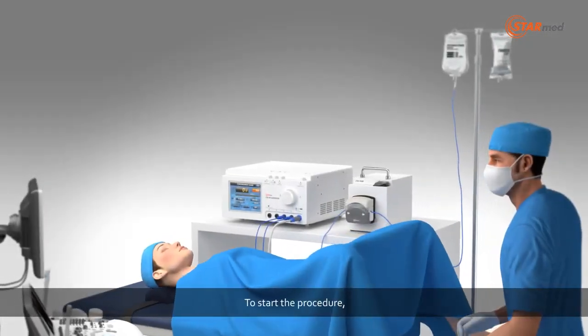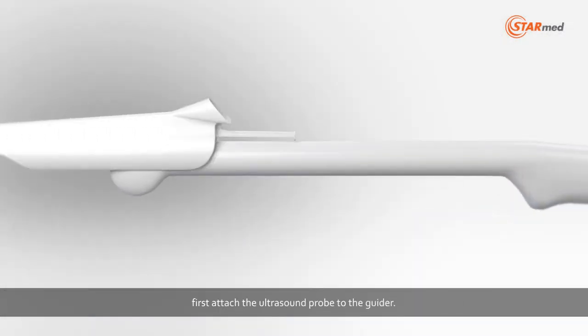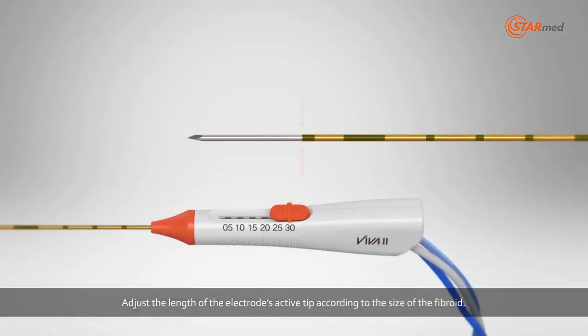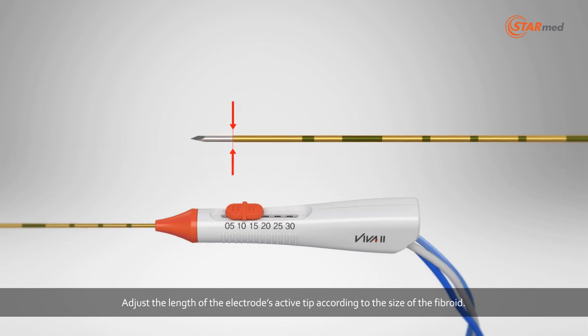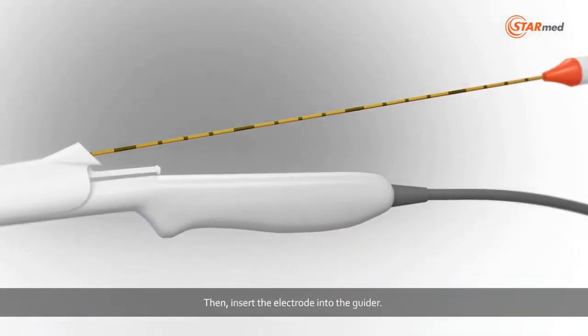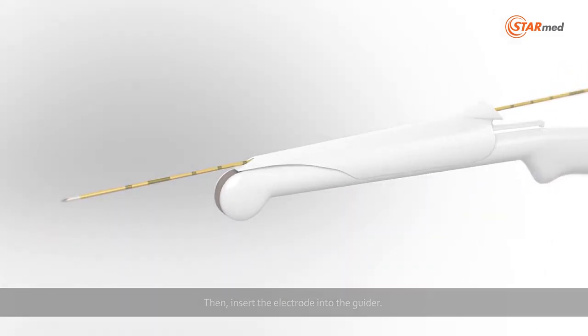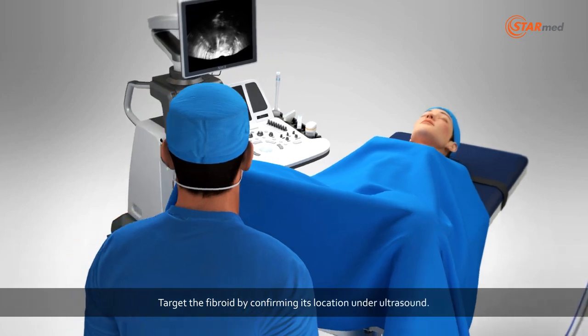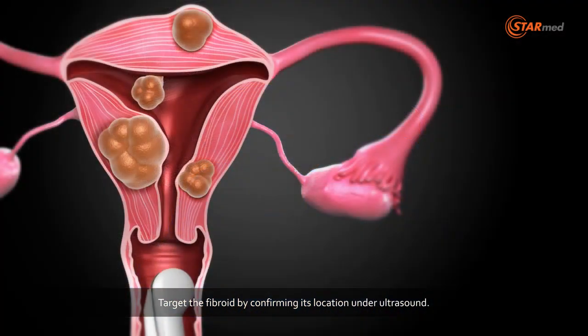To start the procedure, first attach the ultrasound probe to the guider. Adjust the length of the electrode's active tip according to the size of the fibroid. Then insert the electrode into the guider. Target the fibroid by confirming its location under ultrasound.